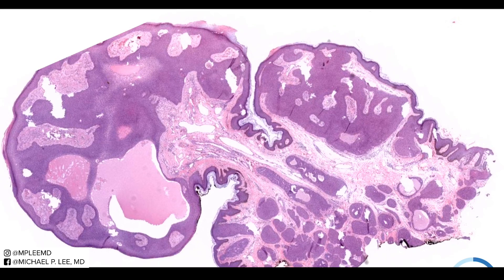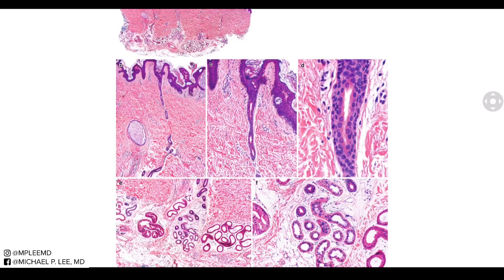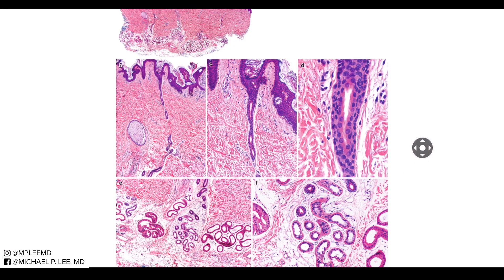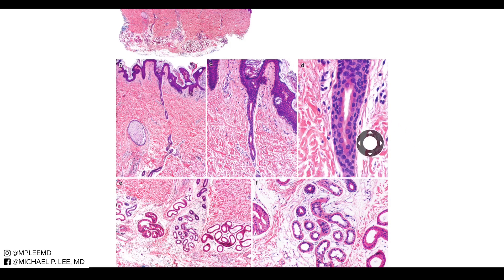Looking at what sweat ducts look like histologically — here is the epidermal surface, and you have this little duct taking sweat to the skin surface. At higher power, you can see that these cells are monomorphic and bland appearing — cuboidal cells lining a cuticle-lined duct.